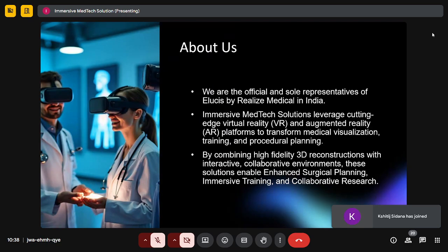Apart from that, we also have various advantages like enhanced surgical planning. The surgeons can directly connect from whichever place they are in a single virtual environment, come together, and do the segmentation. Engineers can also directly carry out the segmentation, as we aren't that familiar with the medical part, the anatomy, but we are familiar with the CAD applications and research-based applications like finite element modeling. So the burden of image processing has been reduced using VR.